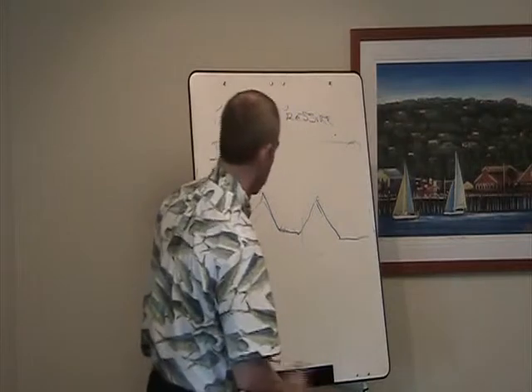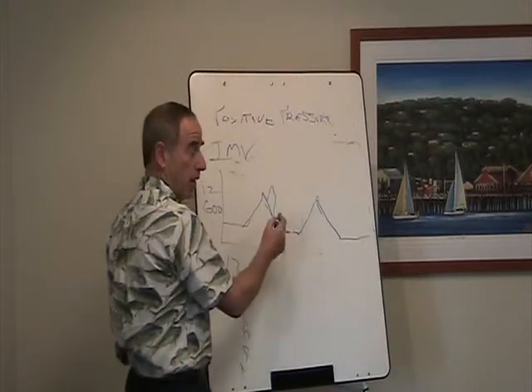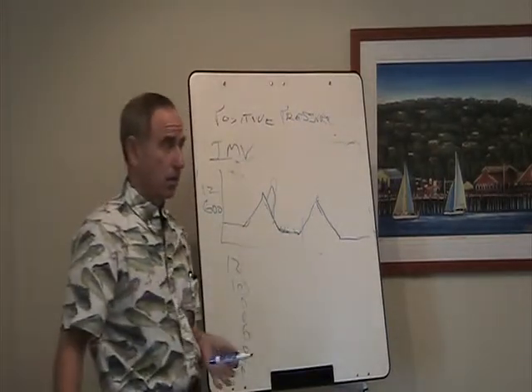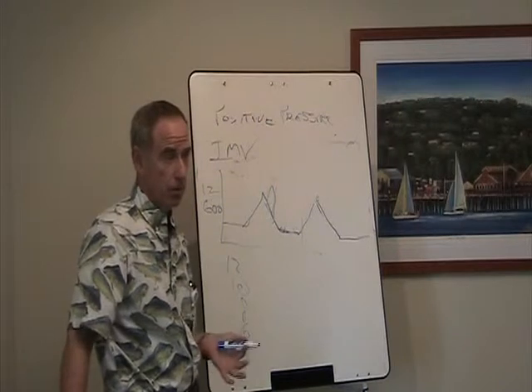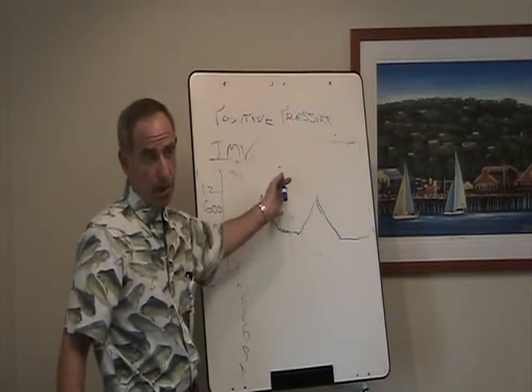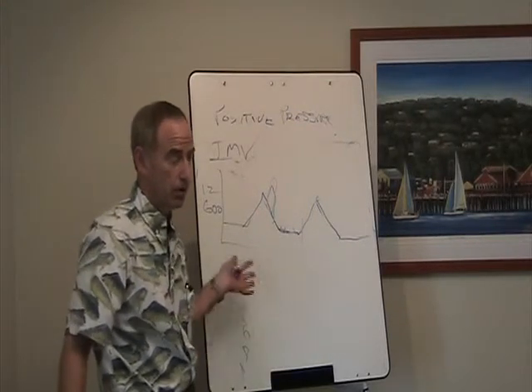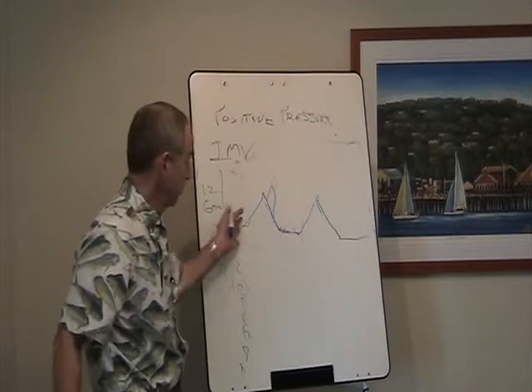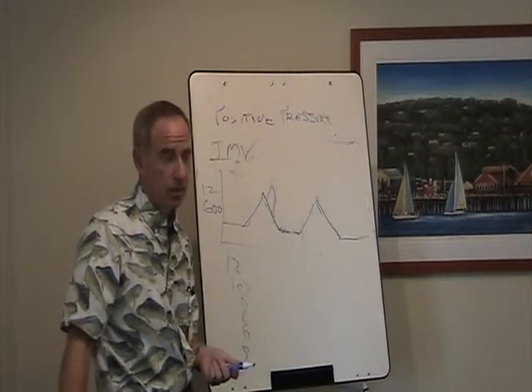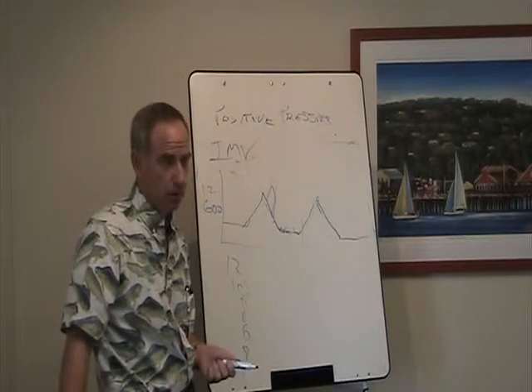Okay. So one of the problems with IMV, after it was introduced, was that if the patient took a breath here instead of down here, what would happen? It's called breath stacking. So they could potentially get a higher volume than what you set. You may have it set at 600, and if they take a breath on top of the 600, they could get a liter or 1,200 cc's, and there was a risk for barotrauma, and there was what was considered ventilator patient asynchrony. So the patient wasn't really synchronizing well with the ventilator.